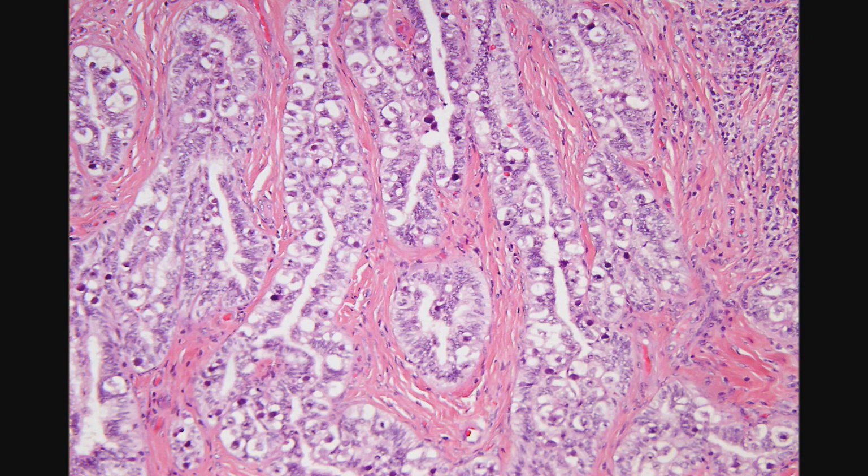Another pitfall is seminoma cells can pagetoid extensively into the rete testis. The rete testis is glandular, so once you see the pagetoid cells in the rete, the pitfall is to call this embryonal carcinoma because you see these cells in glands. The difference is you see normal cells of the rete and then interspersed the pagetoid seminoma cells.